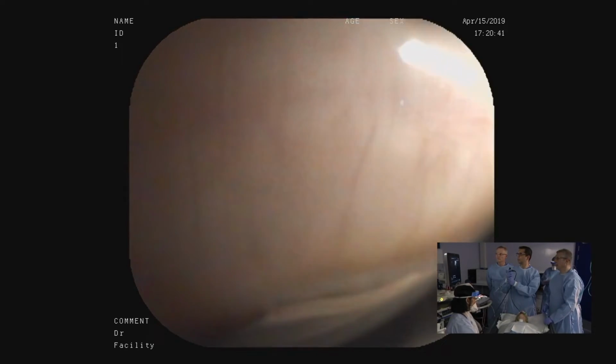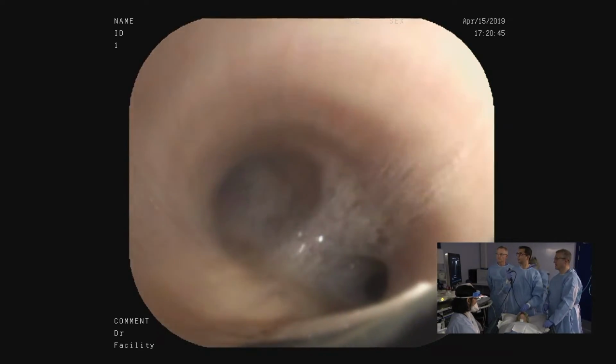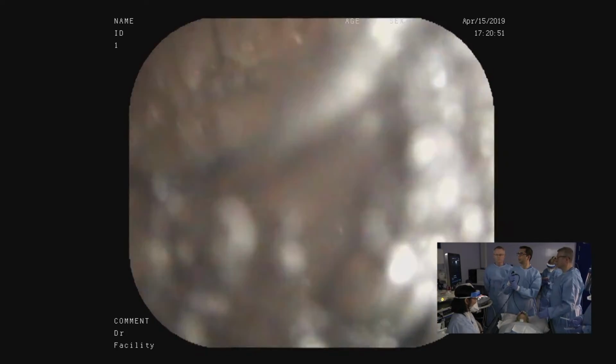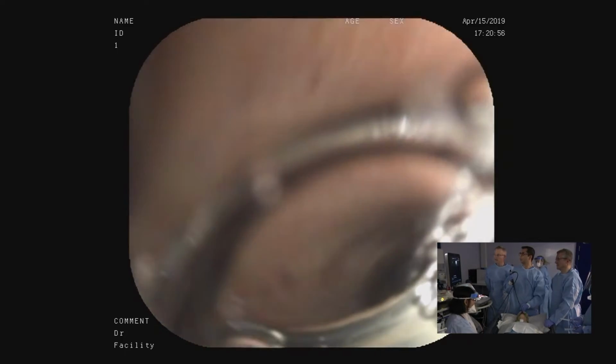And the key feature here is that with the technique of cricothyroid lignocaine injection, the patient shouldn't cough at all. So we've gone through the most sensitive part of the body without any stimulating cough. He's very comfortable. Can I have some lignocaine, please?